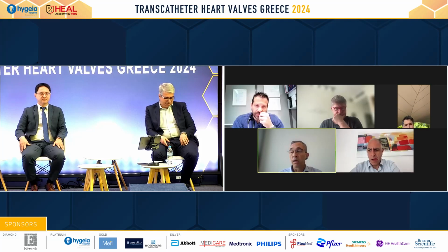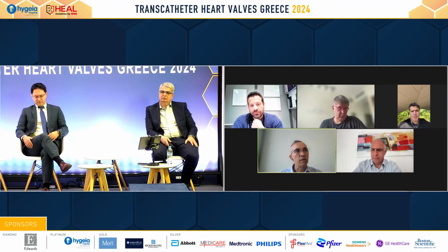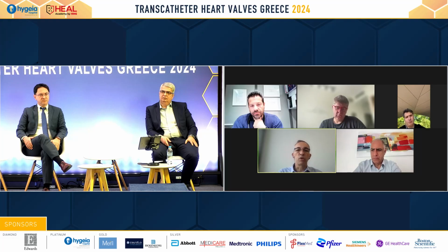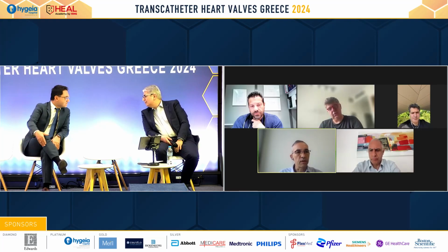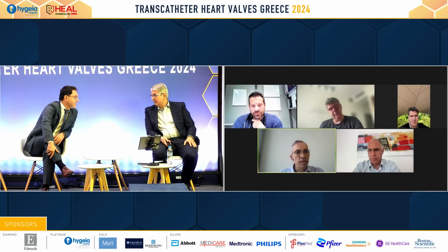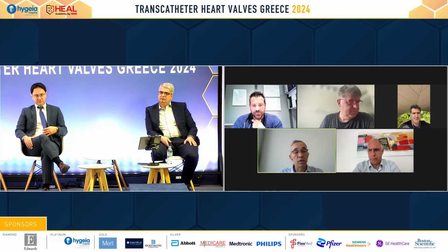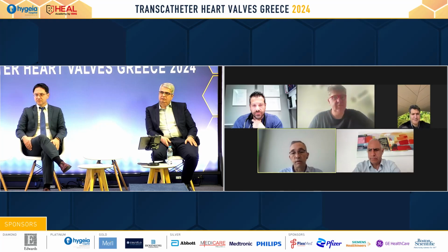And maybe these criteria that I provided are relatively simple, and this is what you may have in guidelines, but maybe we need more advanced imaging to really identify the patients who may respond to TEER versus those where the treatment will be futile and should be treated conservatively. I think myocardial strain may be useful. I think also MRI, T1 mapping, if you have a ventricle that is highly fibrotic, maybe whatever you do, it's not going to remodel and it's not going to respond. And then the indication of TEER would be only for improving quality of life.